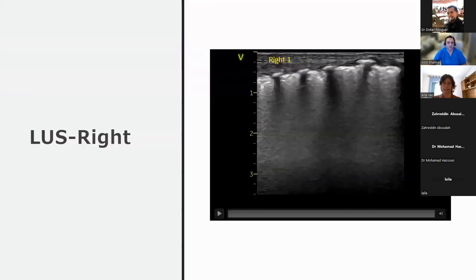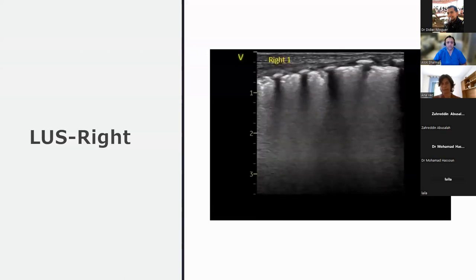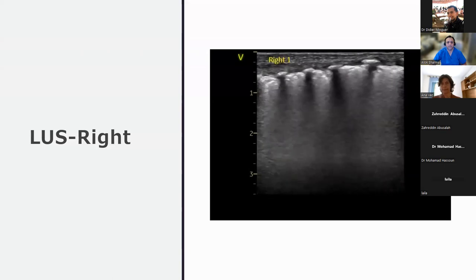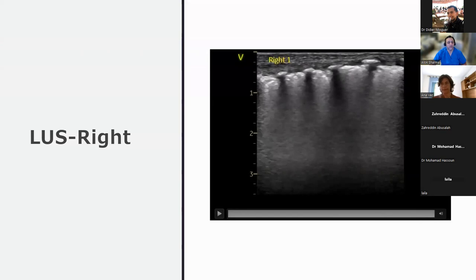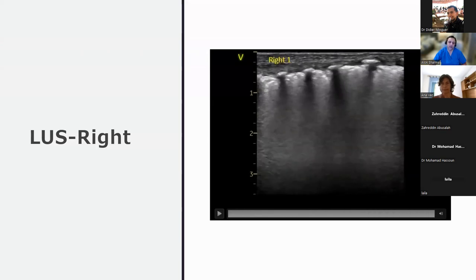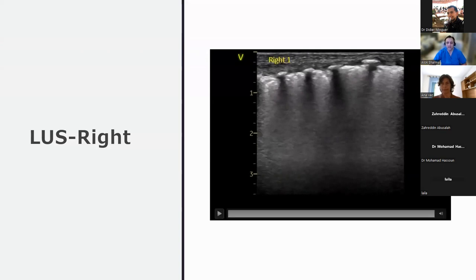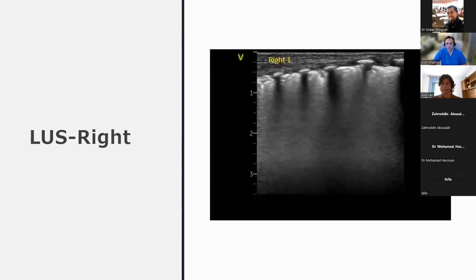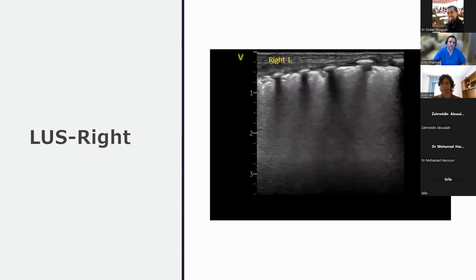So we've talked about the settings. Now, this is R1 for you. With this baby, we are sure that DOPE is okay. Sorry, the DOPE is perfect. So no pneumothorax. The tube is at the right level at the lips. We have had a good color change on the Pedi-Cap. We've got loops coming in and out. The equipment's definitely working, good chest wall movement. And the nurses are quite confident, no secretions. And this is what you see on R1, yeah.